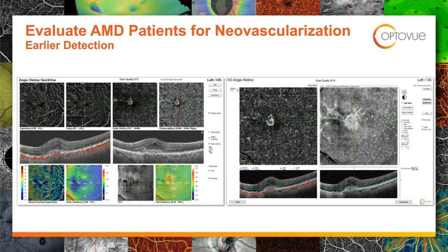And if you just go right above to that third image over, you can see the red line and the green line is right through that area, and that's just depicting right where that choroidal neovascular membrane is. And then the image that's on the right side there, again, the red line and the green line going right through that choroidal neovascular membrane. You could see the scan down below with the angioanalytics, the red activity, the hyper-reflectivity, and that's how you can tell for the doc out there that had the question between an active and passive.